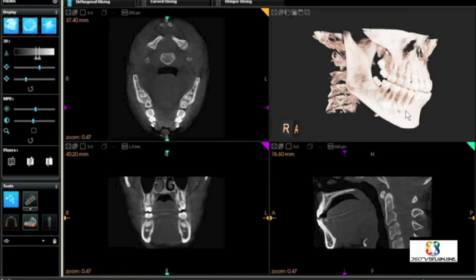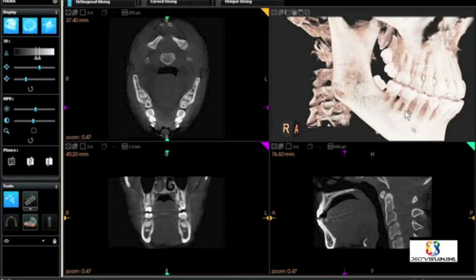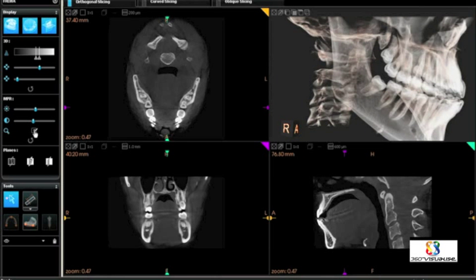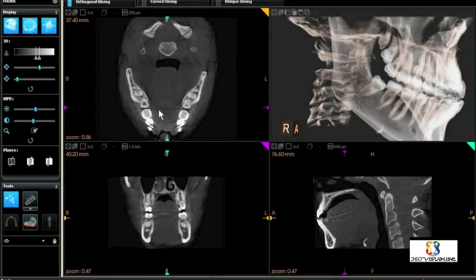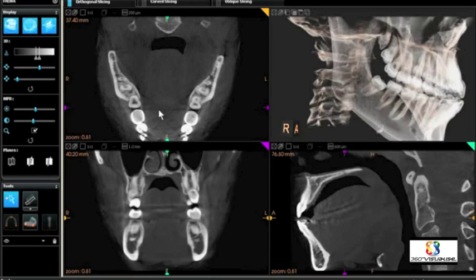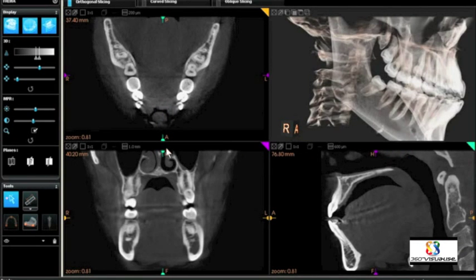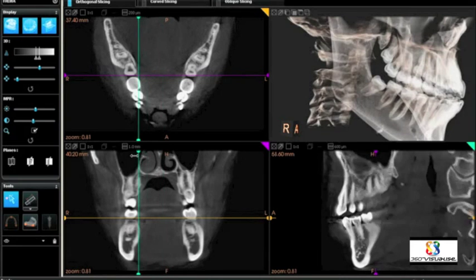On the upper right, you'll see the volumetric view, and by increasing transparency, we're able to see the roots through the bone of the teeth. The upper left panel is the axial view, the lower left panel is the patient's coronal view, and the lower right panel is the sagittal view of the patient.